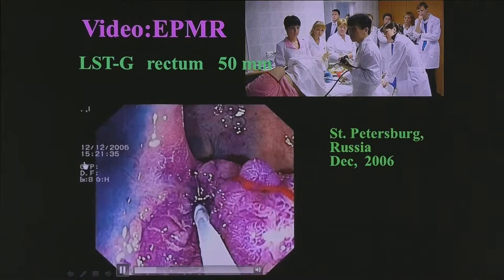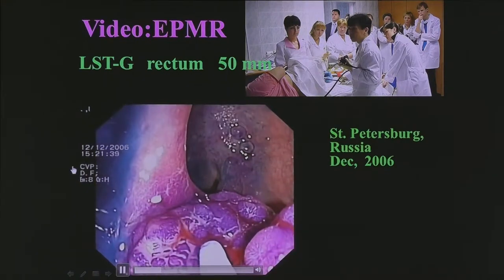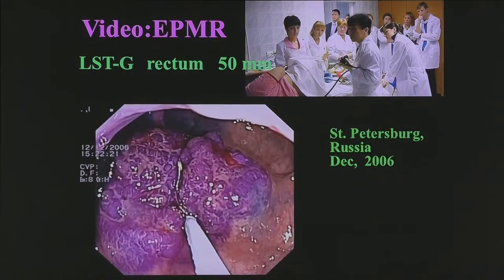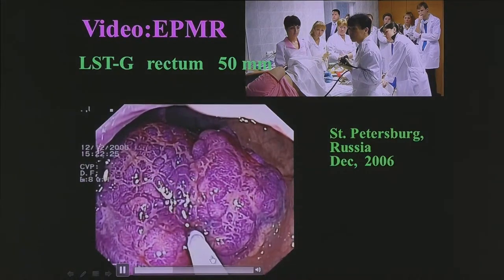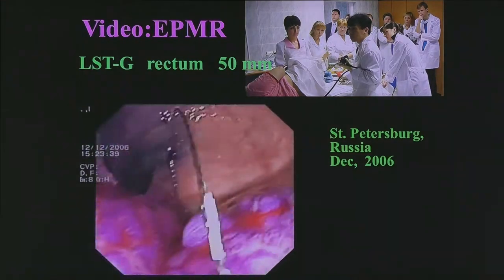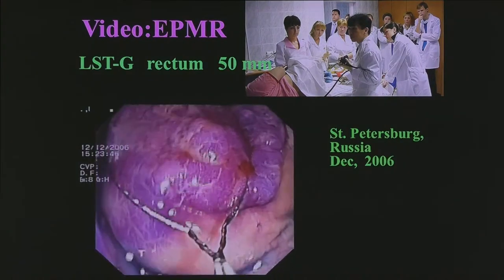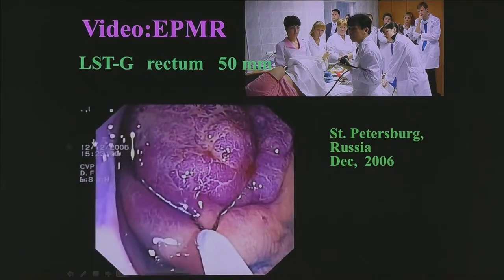I started the injection at 3 o'clock. So withdraw the needle during the injection, that's very important. And the first cut should be as big as possible.